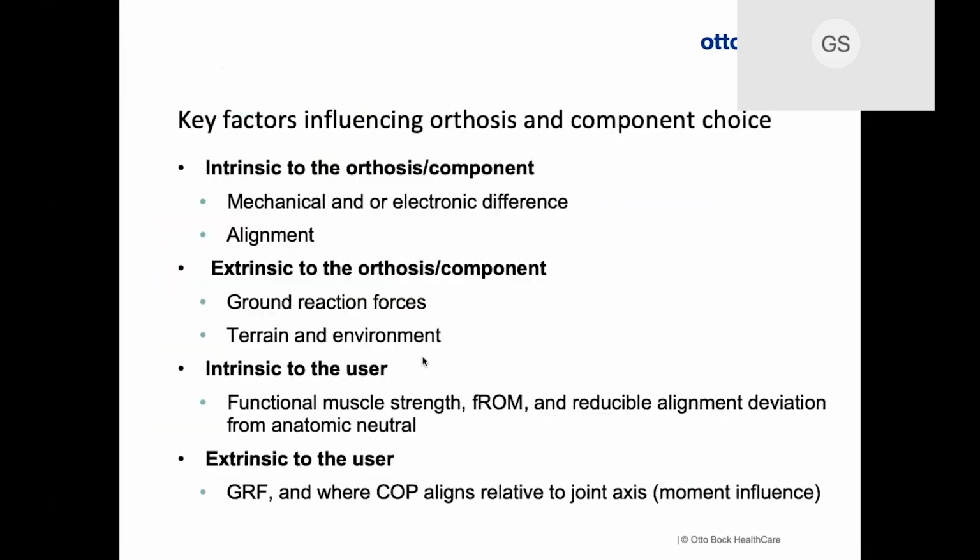All right, so what's the lesson of all that? Well, I could just stay looking at robots all day long. What it's saying is that in gait, there may be not so much a push-off, but that we want to ensure this rollover shape. So when we think about how they are the same or different, I think both things are at play, the 6 determinants of gait as well as the inverted pendulum.